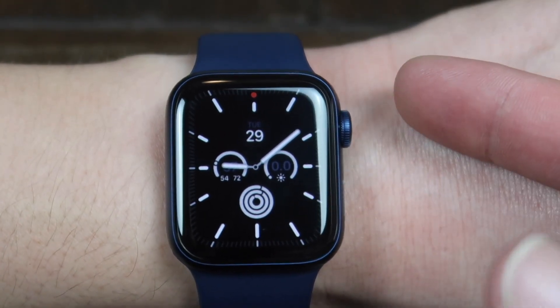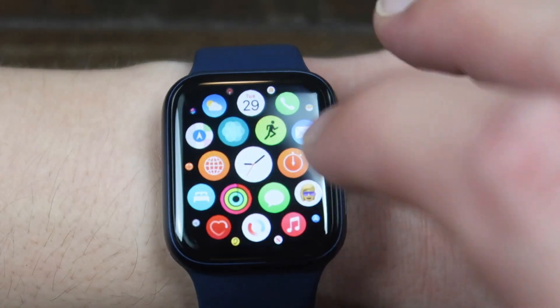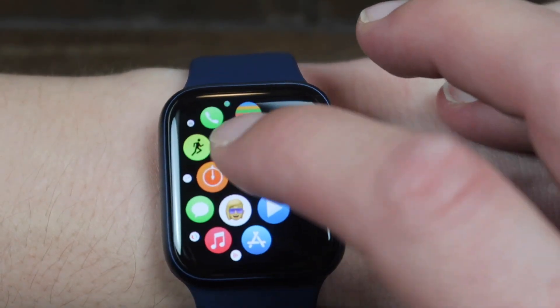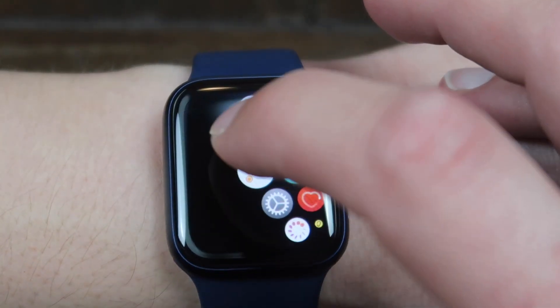I'm going to show you how to do an ECG or an EKG on the Apple Watch Series 6. Really easy. So open up your apps, and then you're going to find the ECG app, which is this one that looks like a little heartbeat.